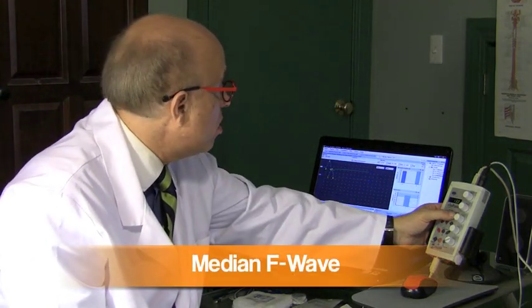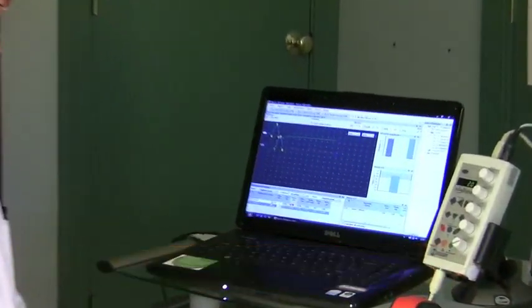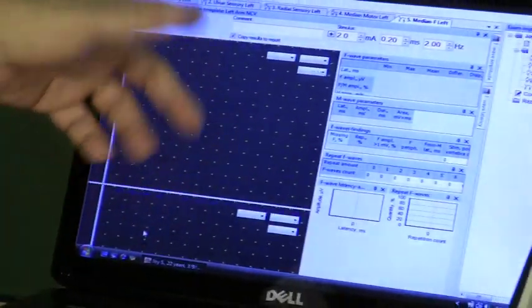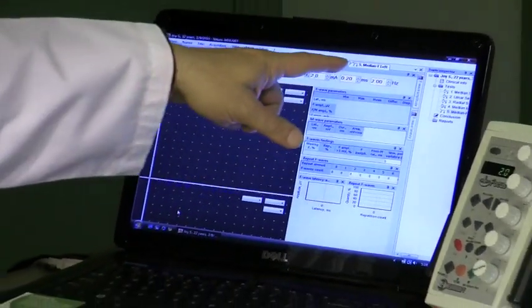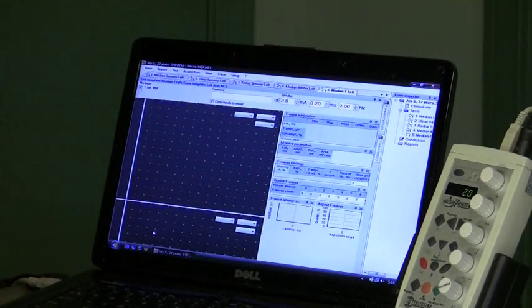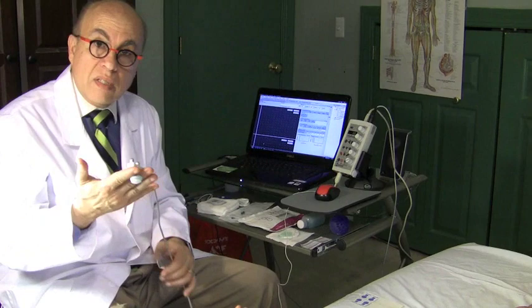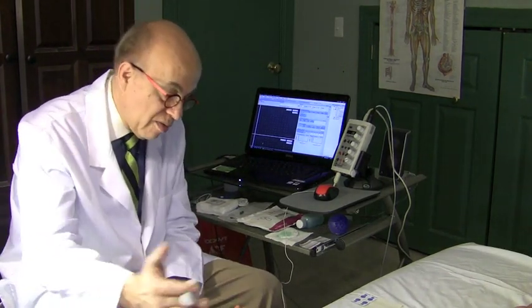Let's go into the F wave mode, and I'm going to press next here. You see that the display changed a little bit. I'm going to show you what that means. It says median F left.